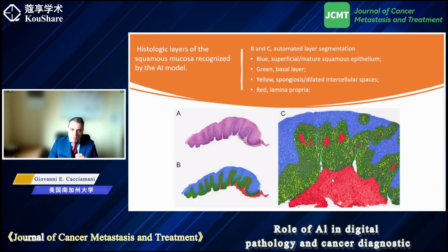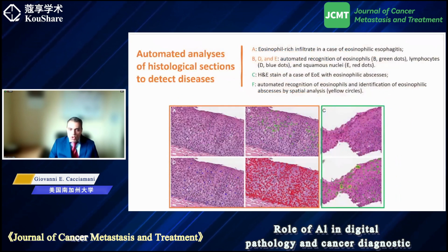So we can train the system to recognize cells. And of course, this can translate, when you deal with pathology, to the recognition of cells that are not supposed to be in the tissue.